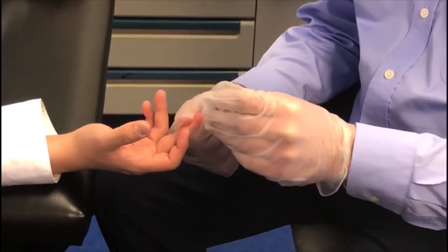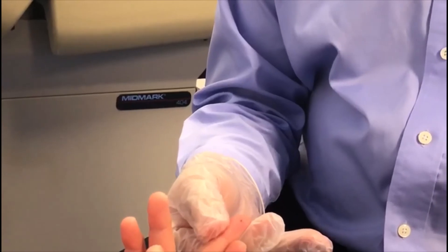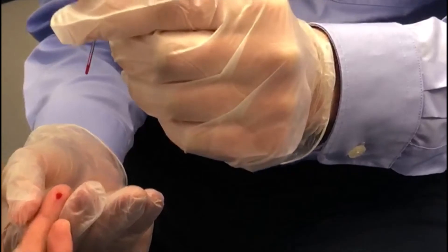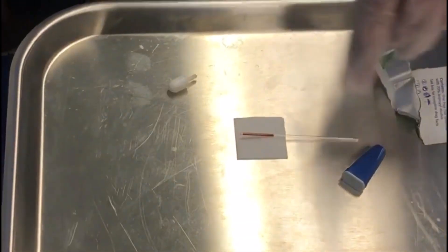I'm going to put this down on the gauze pad — non-contaminated side up, contaminated side down — and roll the finger up just a little bit, then push. Now every safety lancet is a little different, but I'm working at the edge. Grab the micro hematocrit tube, grab the gauze, and squeeze. Wipe away the first drop of blood because of interstitial fluid — the fluid between the tissues. Squeeze and tap the blood; it goes in on its own because of capillary action. I'm not squeezing the finger directly but rolling toward the end — that's what gets you the most blood. There's usually a clay insert to keep blood from moving in the tube, but I'm not using that today.